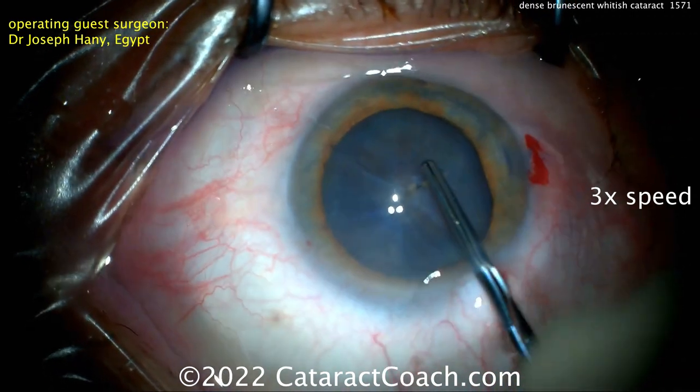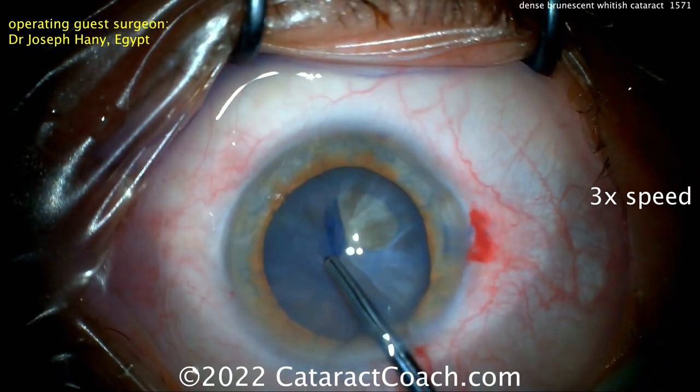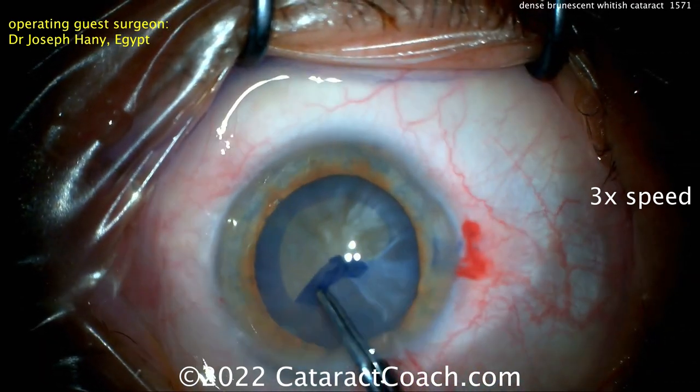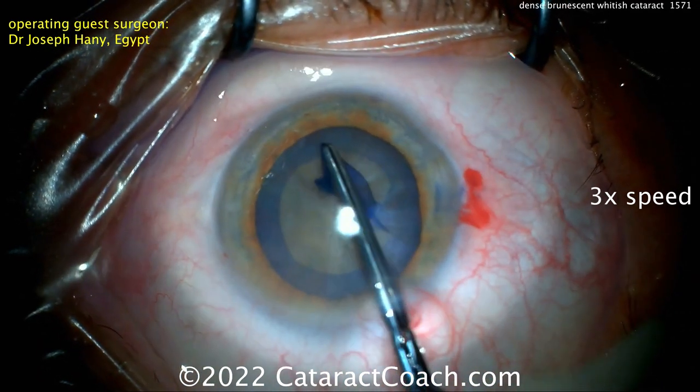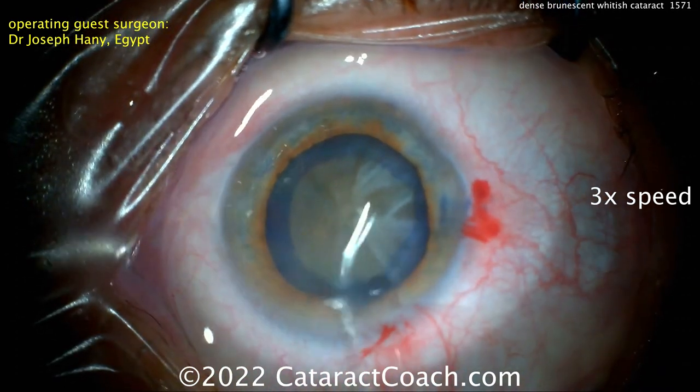Staining the capsule with TriPen Blue — the capsulorhexis is being performed. Be careful in cases like this: some can have an intumescent cataract or pressurized capsule bag, though luckily not in this case. Make sure you get a large rhexis — at least five millimeters. That looks perfect; beautiful job there.